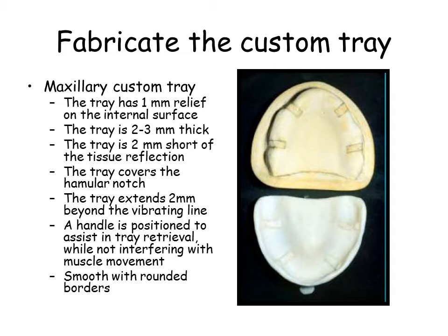The maxillary custom tray is designed to allow the recording of the functional border movements of peripheral tissue. Relief is provided to allow a uniform 1mm space for impression material. It is sufficiently thick to resist breakage. The tray is designed to be 2mm short of the tissue reflections, allowing the functioning of the peripheral limiting tissue to be carried out unimpeded.